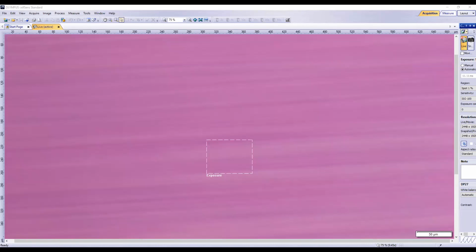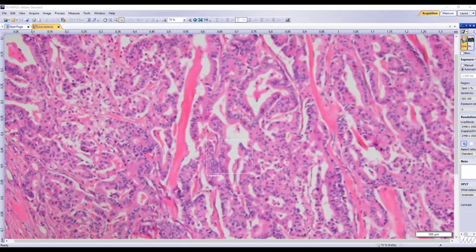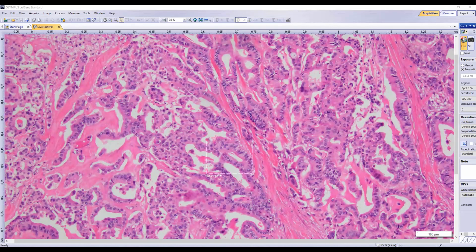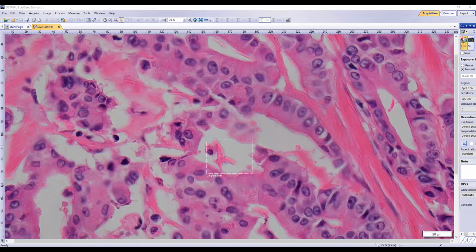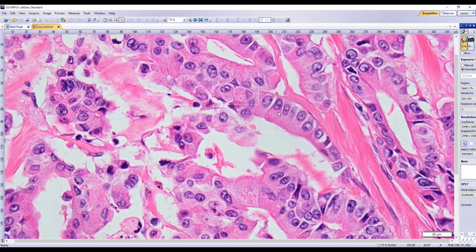it's very easy to think of it as conventional ductal adenocarcinoma. It somewhat looks slightly different. And then when you go closer and look at the cells themselves, do you see the pink granules in the cytoplasm? Yeah, that's zymogen, is that the one?